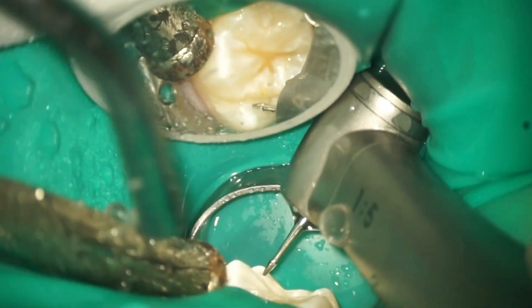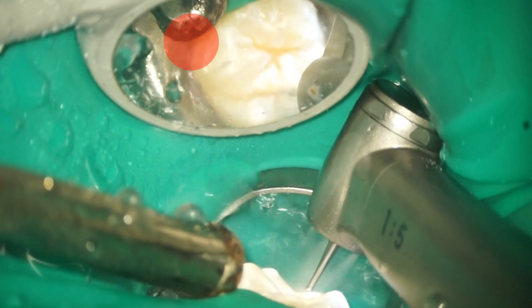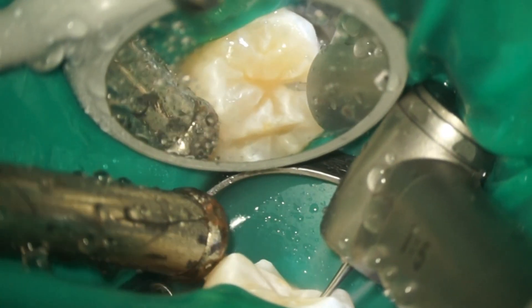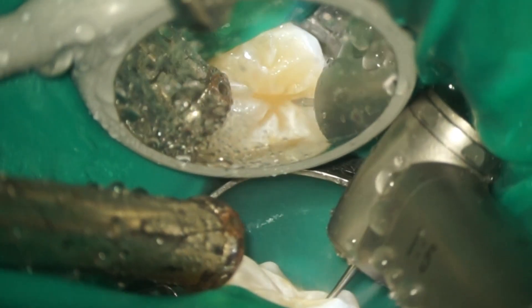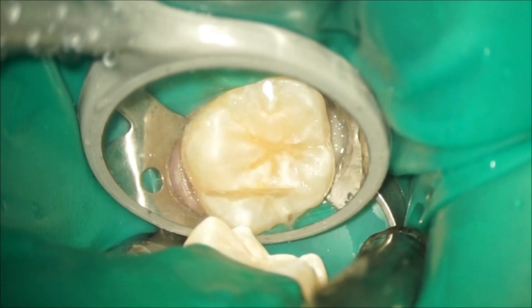In the maxillary molar, try to place the suction tip in the mesial and occlusal directions. The water from the handpiece hits the tooth and then drains into the suction. Conservative preparation was completed under magnification and indirect vision.